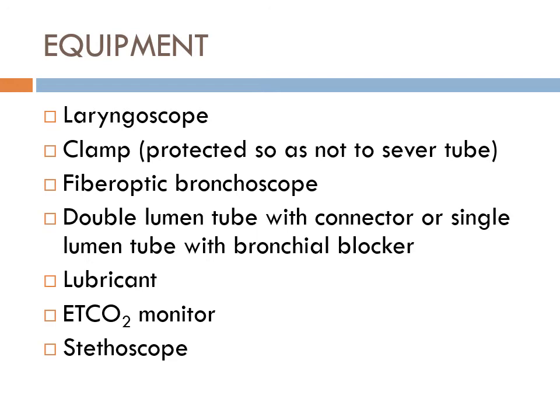All right, who would have thought I'd ever use yellow? So here's this yellow piece that's like our thing, and this is coming off like that, right? So what we're watching to do is watch to see this get seated in the right side that we want to include. Now with this thing, this is nice because there's actually two balloons on here, and it corresponds to these two things too. I think basically this is more yellow, that's more blue.